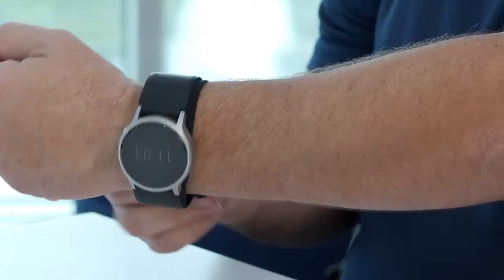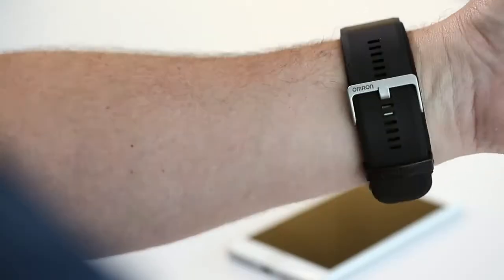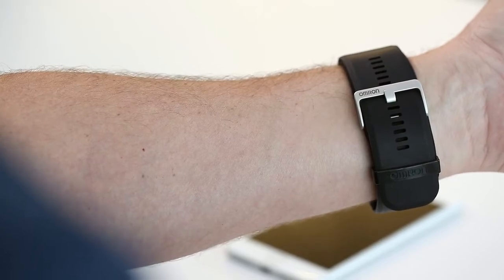Step 2: in order to secure an accurate measurement, adjust the band so it fits comfortably yet firmly around the wrist. As a good gauge of fit, you should not be able to insert your index finger beneath the band.